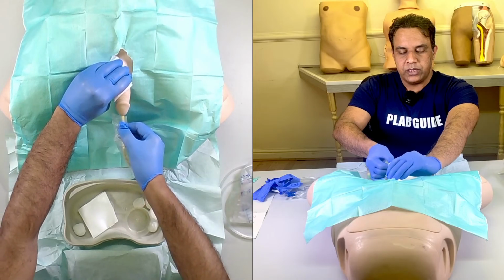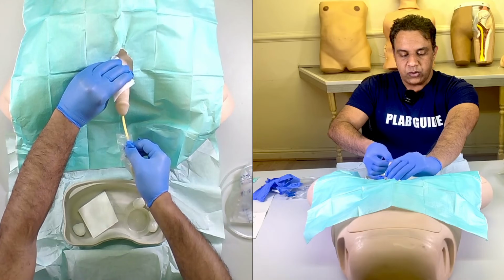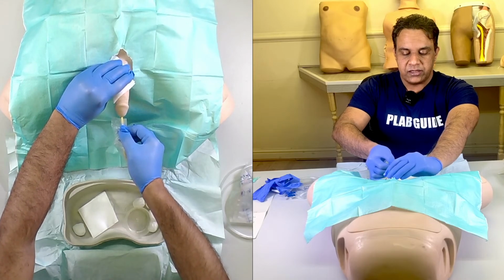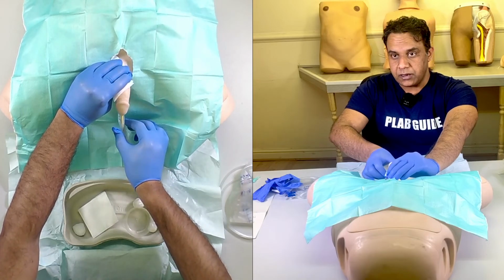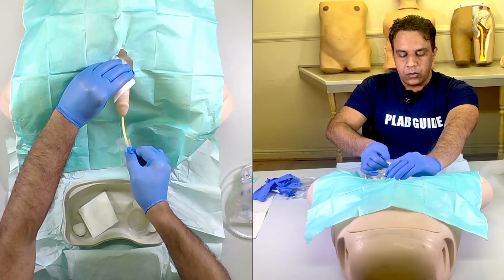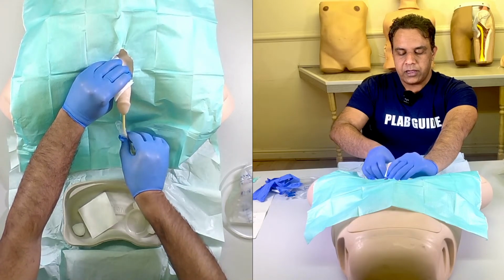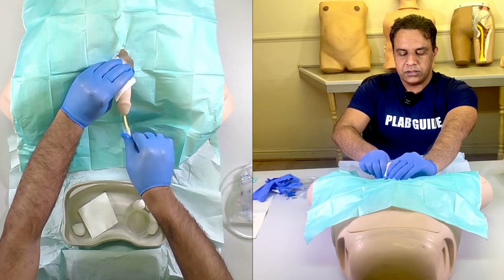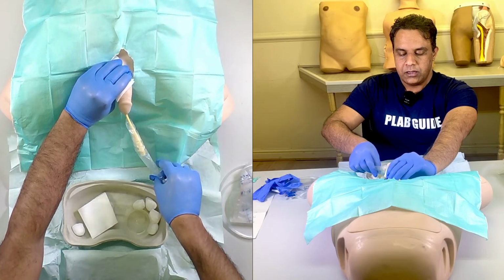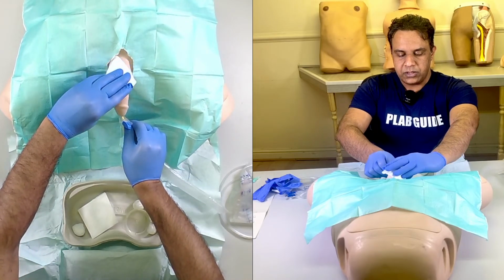In this way you continue till you reach the Y junction. At no point should you touch the catheter directly with your gloves, even if they are sterile. Pinch, insert, slide it back, and continue doing that till you reach the Y junction.